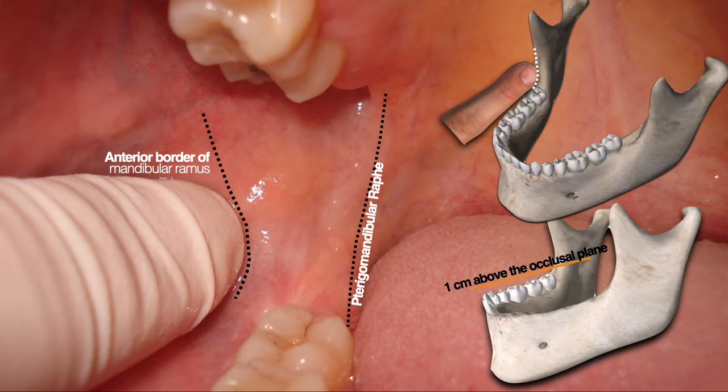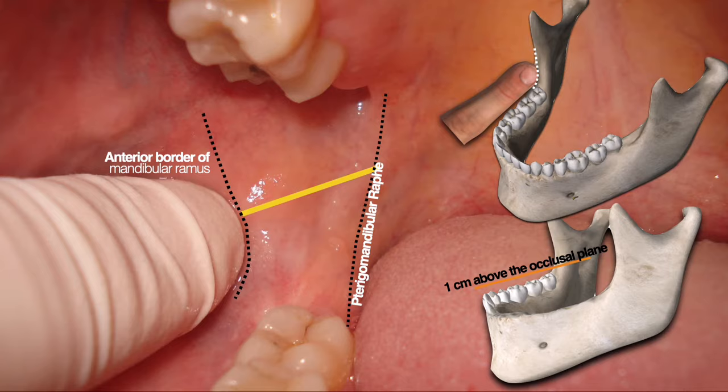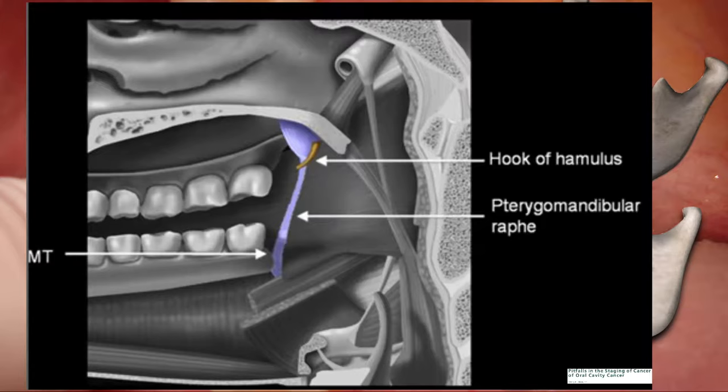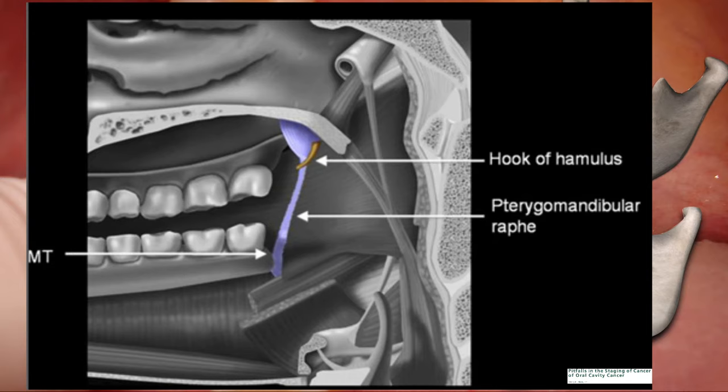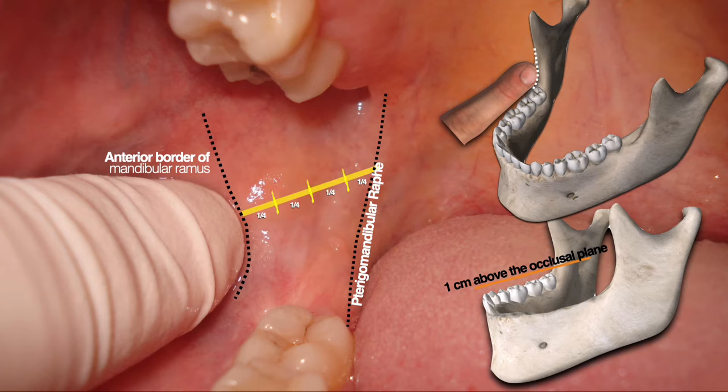Taking these structures into account, you will draw an imaginary straight line from the center of your fingertip to the deepest part of the pterygomandibular raphe. The raphe starts from the region of the retromolar trigon and goes toward one extremity — the hamulus of the medial pterygoid plate. In this path, it deepens in a certain place. The next step is to divide this imaginary line into four parts.